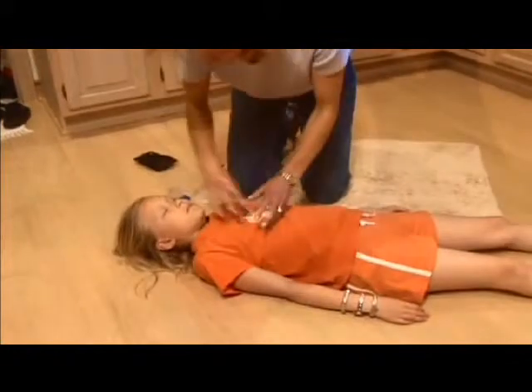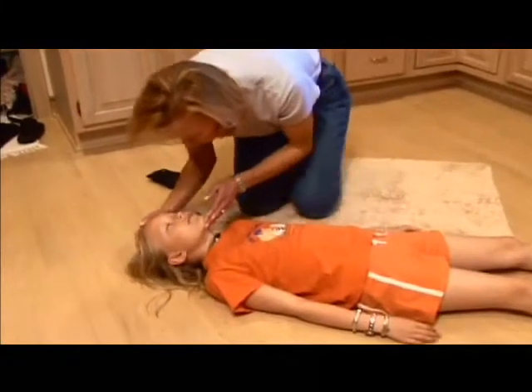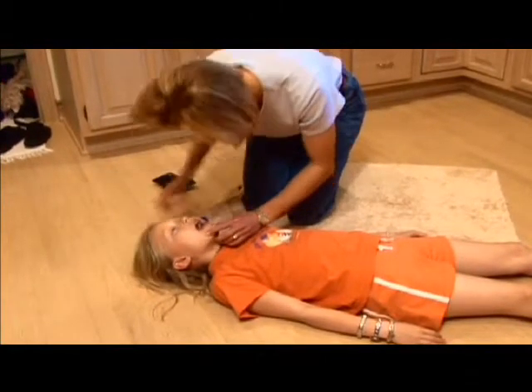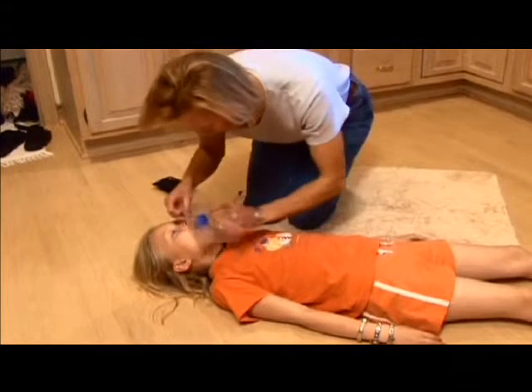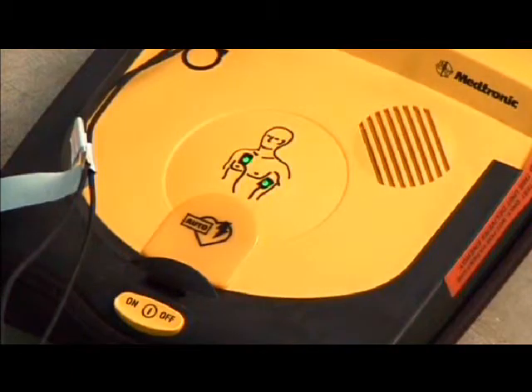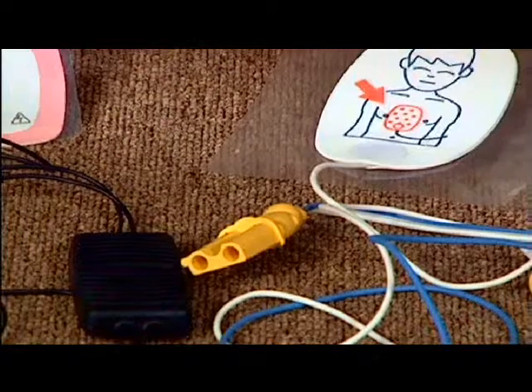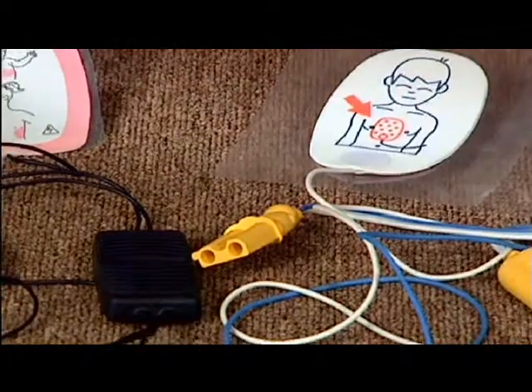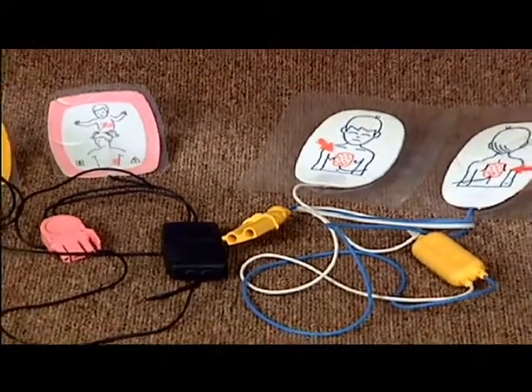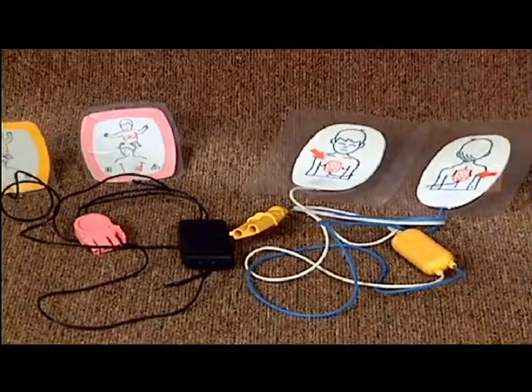Cardiac arrest in children is rare and is usually caused by an airway obstruction or breathing problem. In general, no one expects an individual to recognize the exact age of a child. AEDs can safely be used on anyone ages one and older. If your device has specialized pediatric pads, use them.